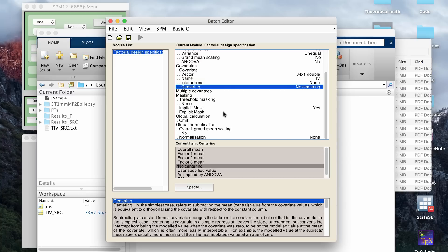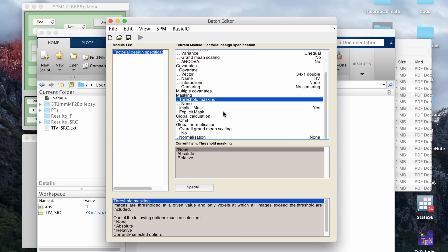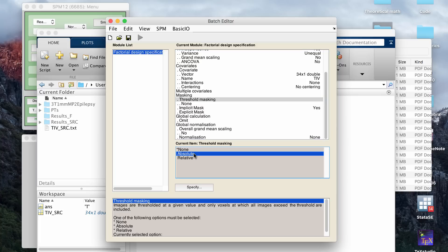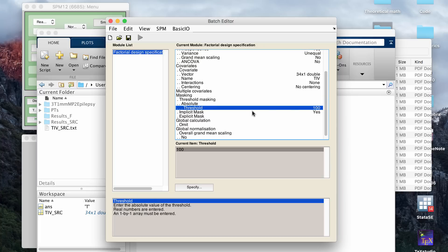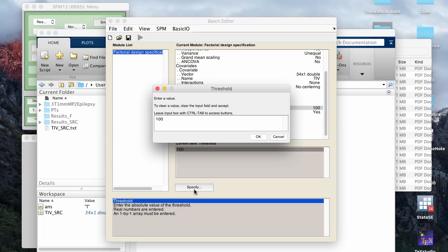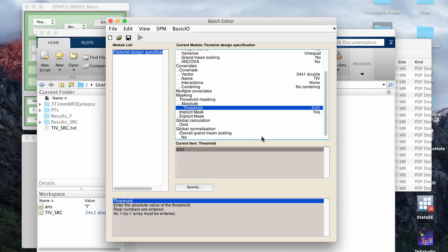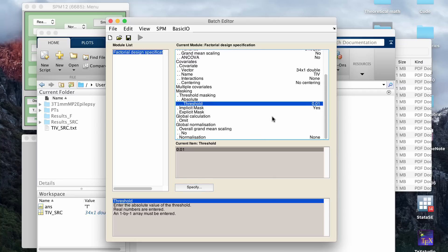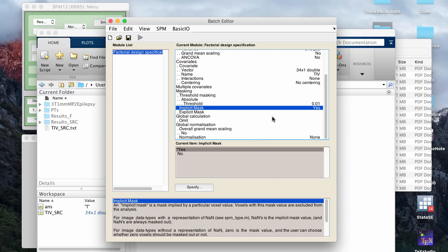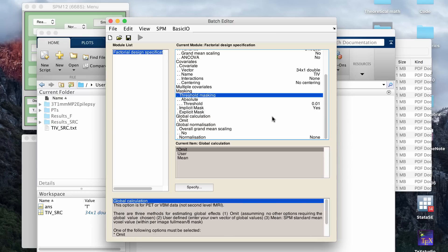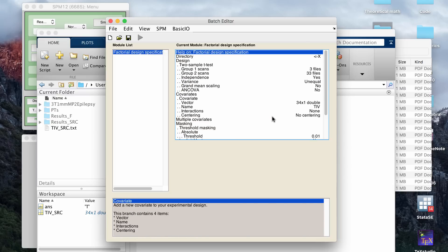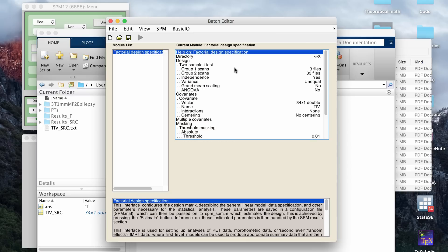Then like I said, we already do no centering. I get this information just from the manual. So it says to do absolute masking, and then you want to set the threshold. So you can do 0.01 or 0.02. 0.02 obviously is a little bit of a higher threshold. I usually just do 0.01 and that works fine. And then again, I don't change any of the following defaults.